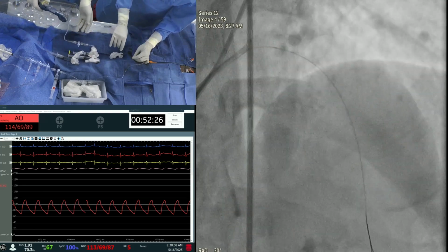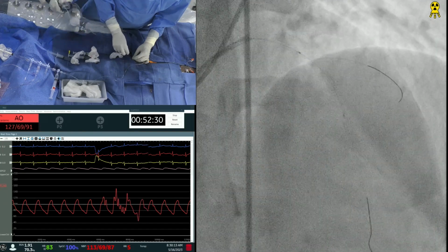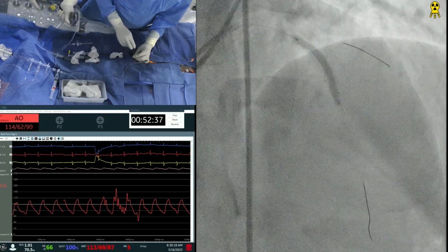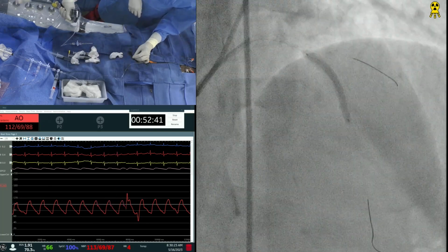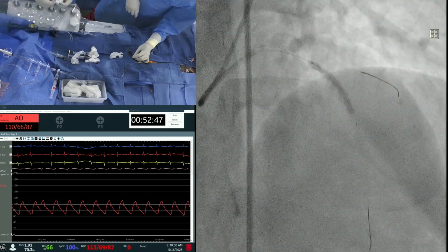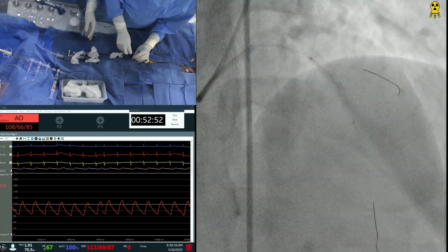I was just saving time. Leave it here. Now, has that area opened up after the diagonal? If not, then we have IVL ready, a 3.0 IVL. I think it's opened up. It's expanded very nicely.